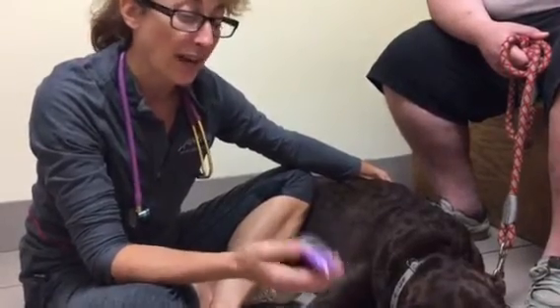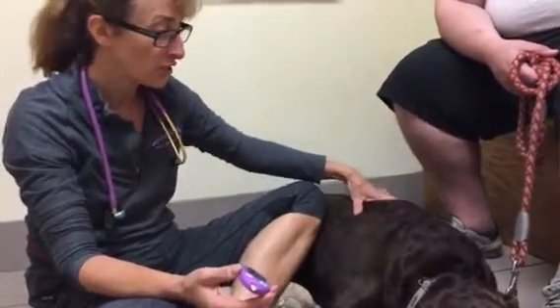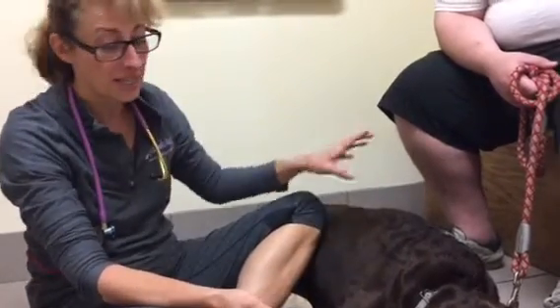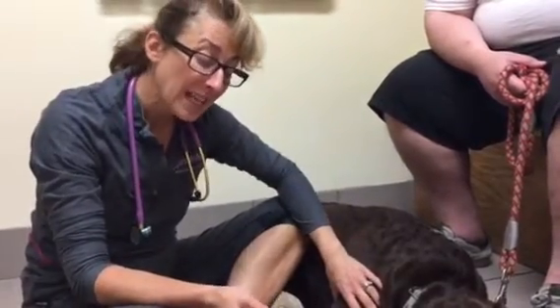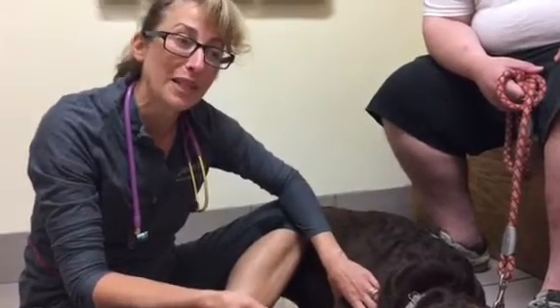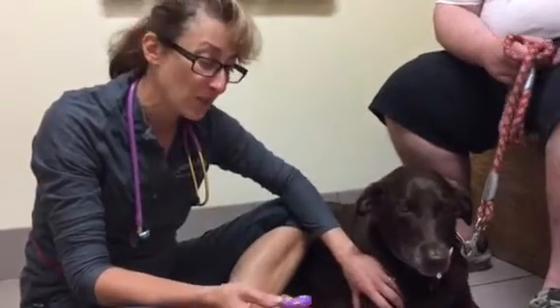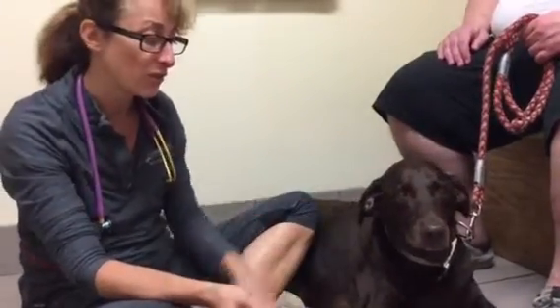Talk to your vet about how often you should be testing at home and how often you need to be testing at the office, and some other monitoring tricks and tips. Ladybug's going to go home and get her insulin — we've just given her dad a little demo on how to do it. If you have any questions, you can find me anytime here at Jarrett's Full Vet or kali.com. If you want to be doing at-home care for your dog, talk to your vet about which glucometer, how much they cost, how you can monitor at home, and how they'll help you follow up. I'm really morally opposed to veterinarians saying that you have to do it at home — you don't. You can do it at home as long as your veterinarian will work with you to help you understand what these numbers mean and how to treat your dog appropriately.